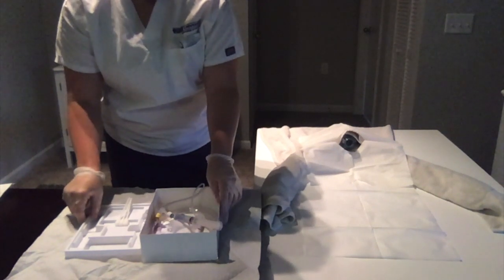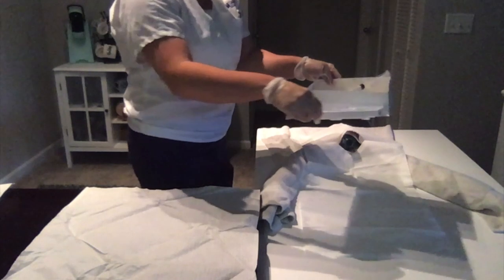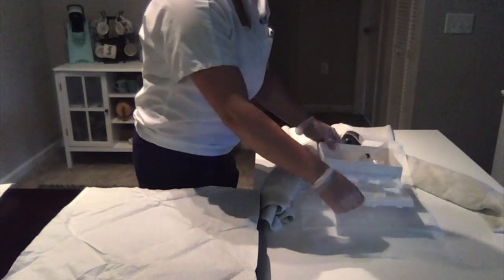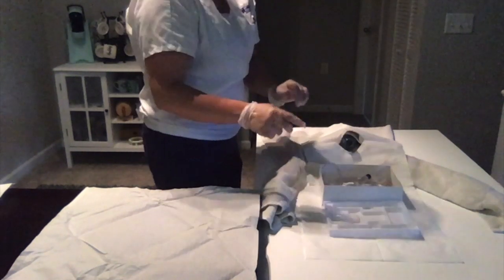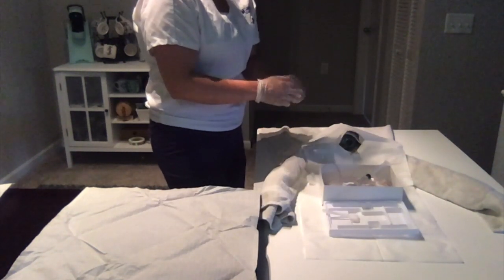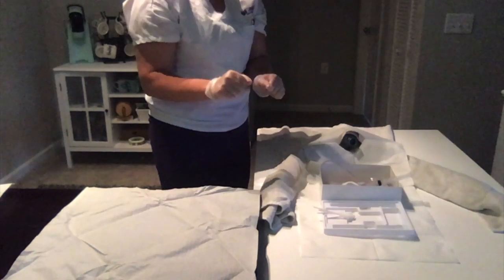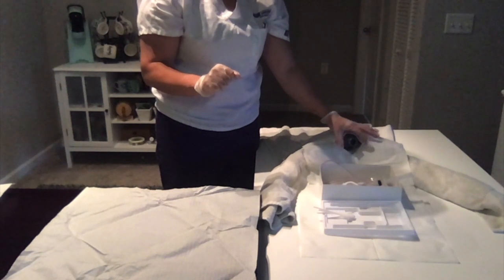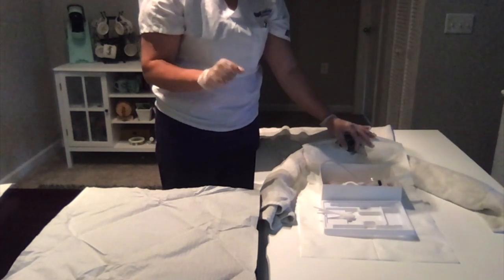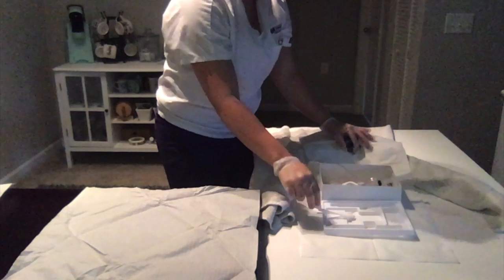So I'm going to take these side by side like this, and then I'm going to drop it straight down onto my sterile field. So I'm looking at the 1-inch border as well as the proximity to the vagina. After I place it down, directly down, I'm going to take this hand, and it's going to be non-sterile, because I'm going to spread the labia and make sure that I can identify the urinary meatus.